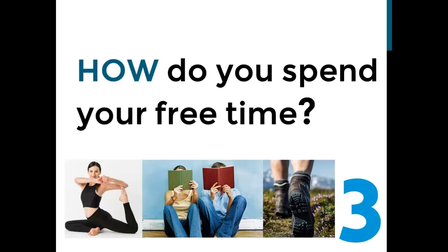Is there anybody that you've done the opposite? Not as far as photographers. We've had a couple that, as a sport, they hunt, and right. It was cross-dominancy per se as far as eye and hand, and we did go ahead and put it in the dominant eye because they actually scoped with the other eye. And that was more of an issue for them than just having it in their dominant eye. But I think we've done maybe just one or two that way.